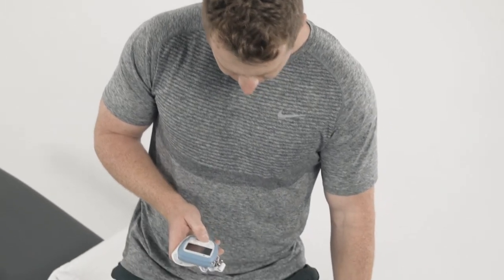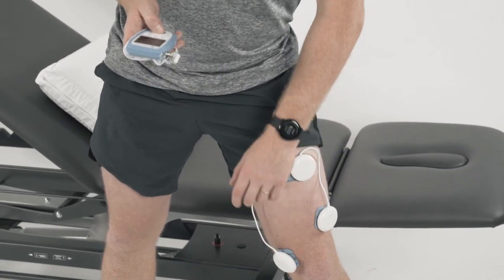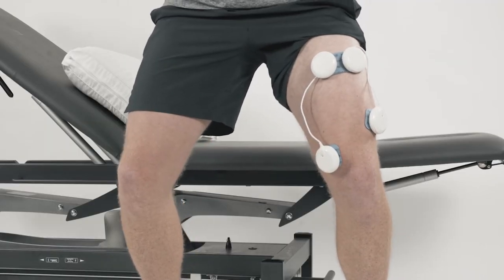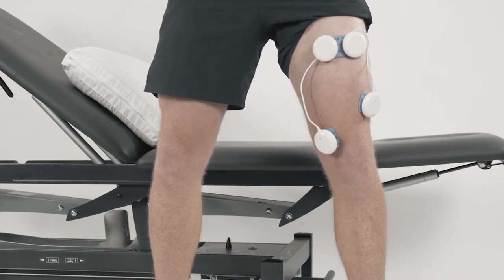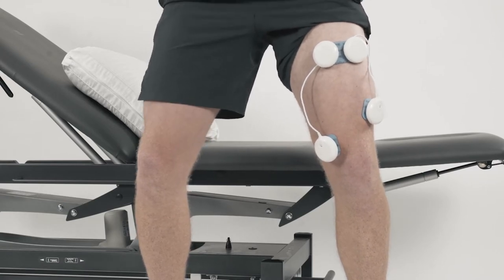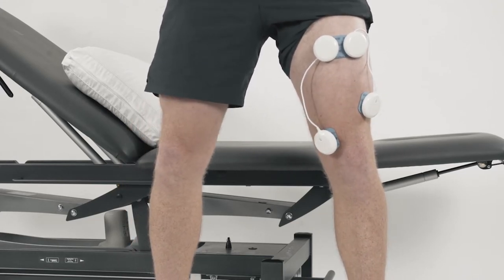With our patient here, they have their electrodes in the same positioning as they did for the static quadriceps exercise. What we're asking the patient to do is actively work through the active phase of the contraction cycle in the program. The patient in this case will do two to three mini squats during the active phase. What we are looking at there is that superimposed contraction on the patient's own voluntary contraction. For most patients, depending on tolerance, you'd get 10 repetitions out per set and, like any exercise program, have a minute or so rest between each set depending on the patient's tolerance.